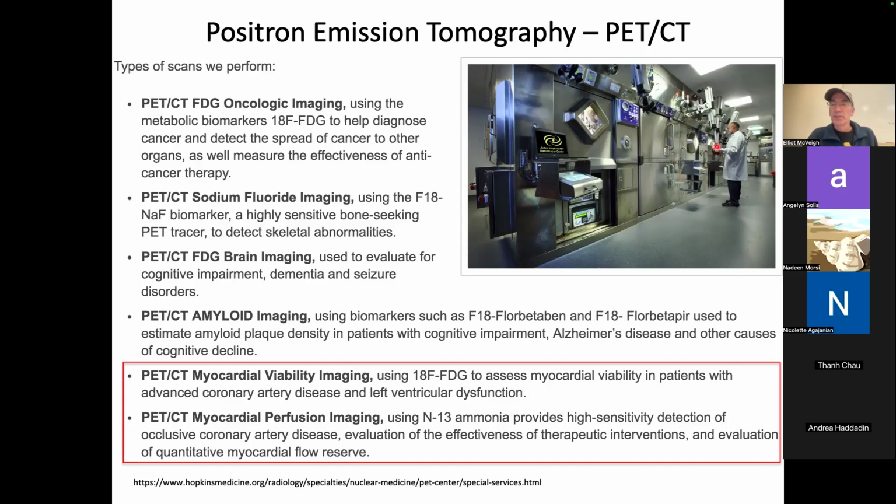And so this person is operating with robotic hands here because inside this chamber, it's just lots of radiation going on, right? These things are radioactive. And so you do all that. When you do your chemistry quickly and you make the substance you're going to inject into the patient, if it only has a 1 minute half-life, you hope that the PET scanner is like next door, right? Or down the hall or something. So this has to be on site, this thing. You can't just do this in Sorrento Valley in some cheap place and then ship the stuff up here. You got to have it right there on site.